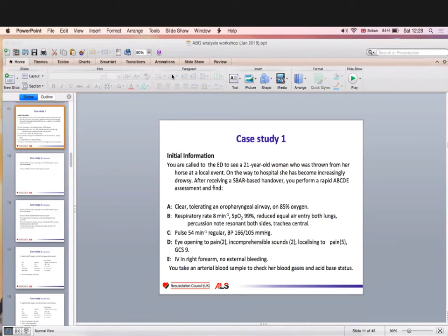Minus 10. Or minus 2, minus 2 or minus 3. There can be slight metabolic acidosis or it can be normal. Base excess minus 2 to plus 2. Right? Then lactate.